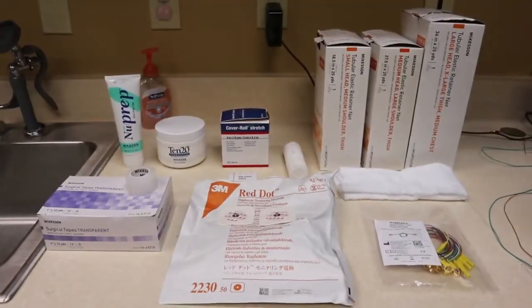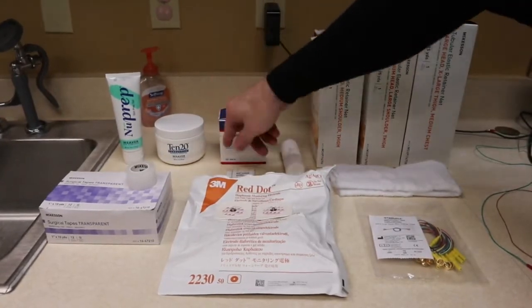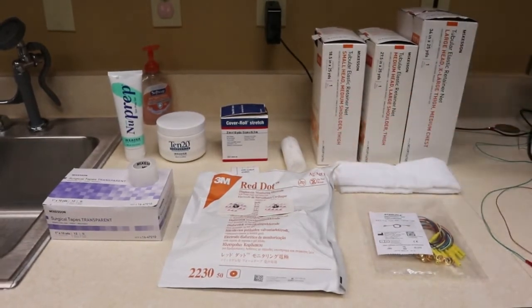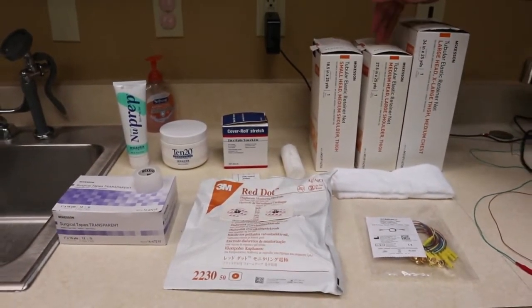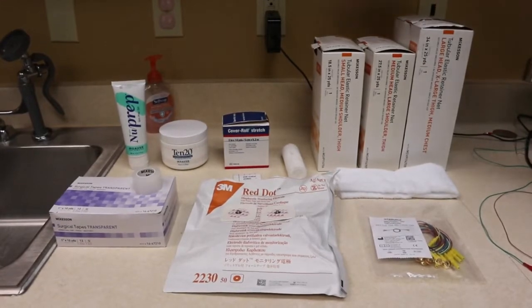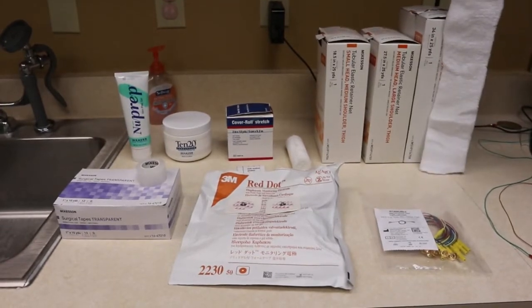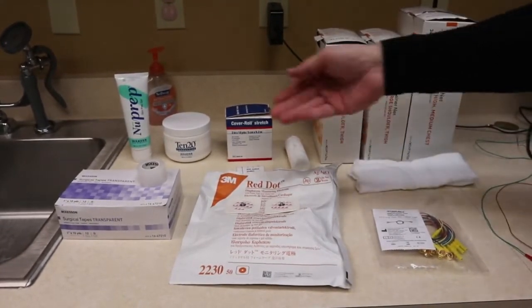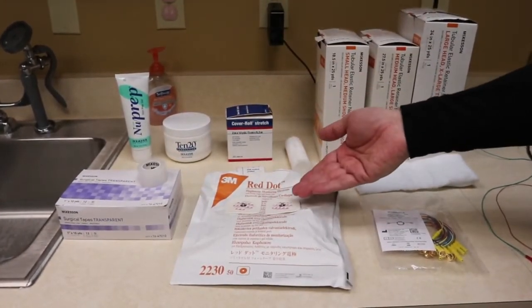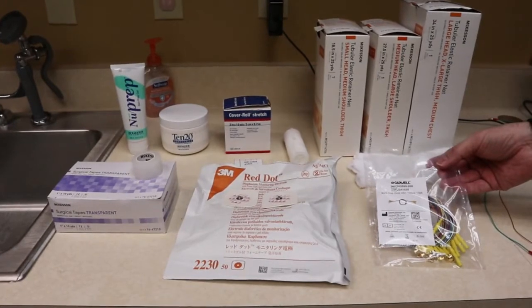Let me go ahead and show you the equipment. Here's just your standard Nuprep 1020. I use this cover roll stretch tape that I cut into three by five pieces. One roll of gauze. These are the nets I use — I typically use size 7 for most of my patients. If their head circumference is about 60 or bigger, I'll go with size 8. If it's lower than 53, I'll go with size 6. I usually cut them at about 16 inches long. Just surgical tape — the transparent works best for me. I use these red dot EKG leads. And for the electrodes, I use these Cadwell electrodes. I like them because they're very thin.